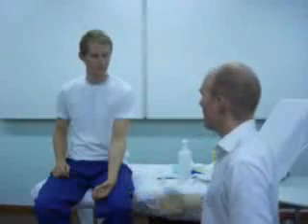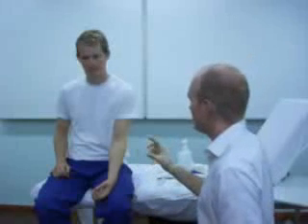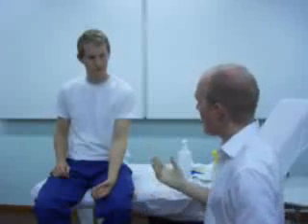Okay, for this video I'm going to show you an example of putting a cannula into a patient's arm in an exam type situation. So again, first introduce yourself, seek consent for the cannula, so you explain: you just need to put a small tube into the arm called a cannula. It's just a little drip that we pop into the arm that we can give medicines and fluids by.